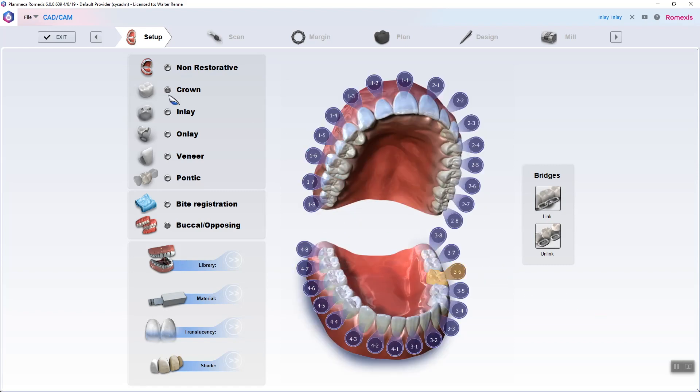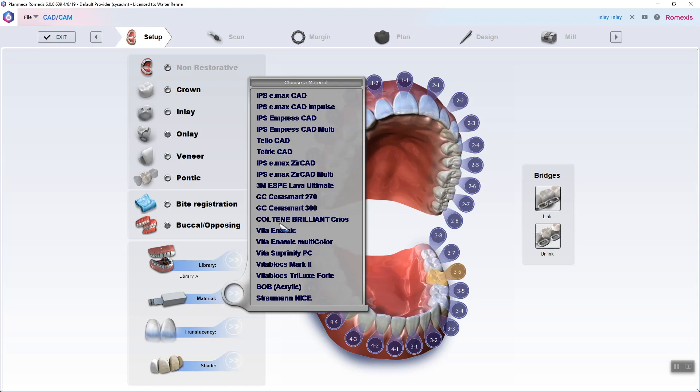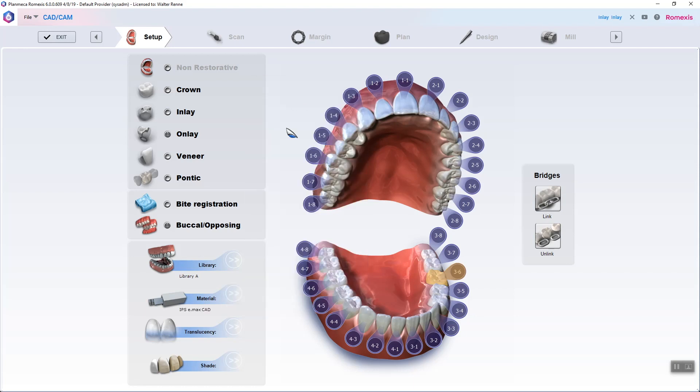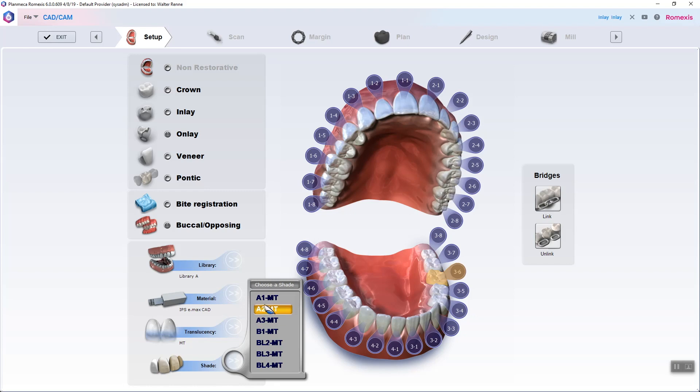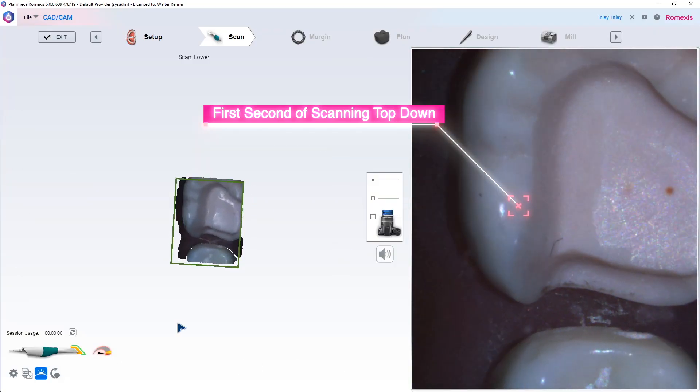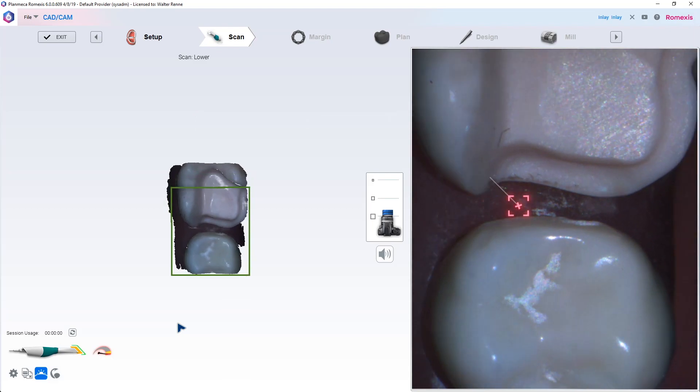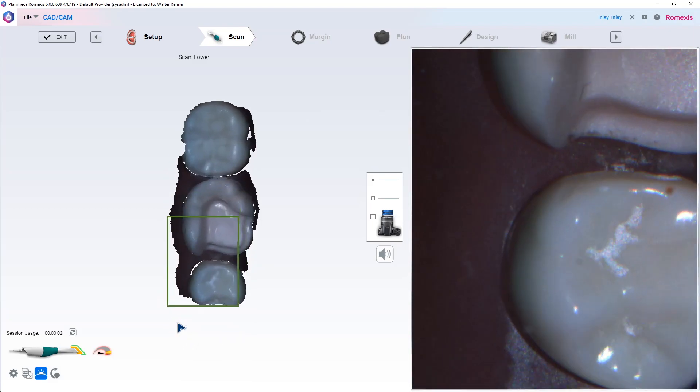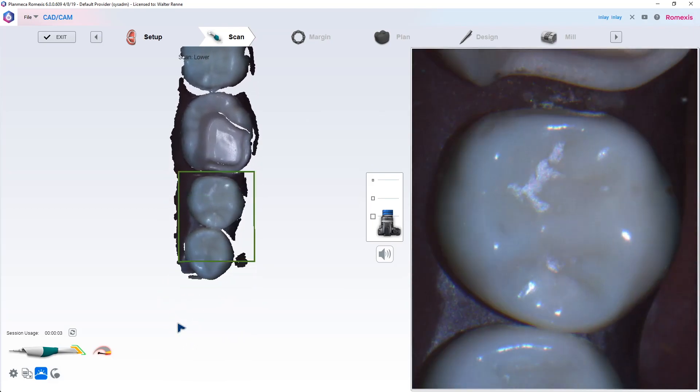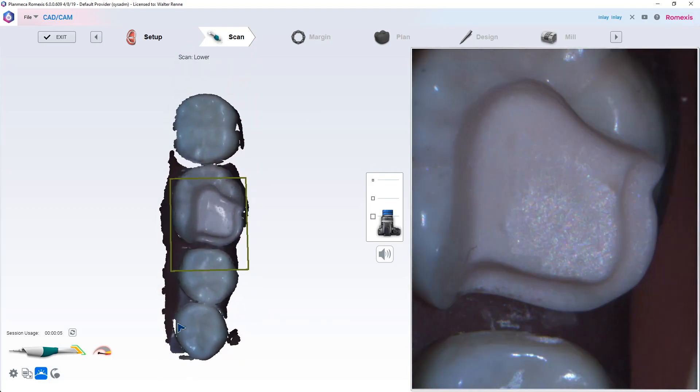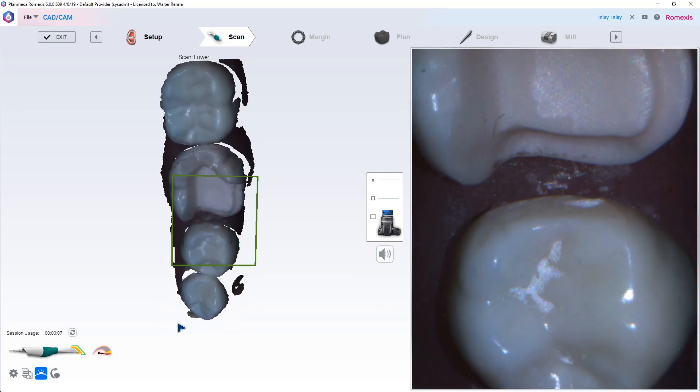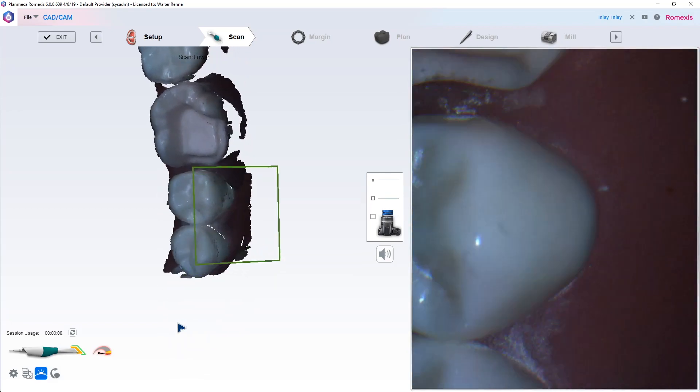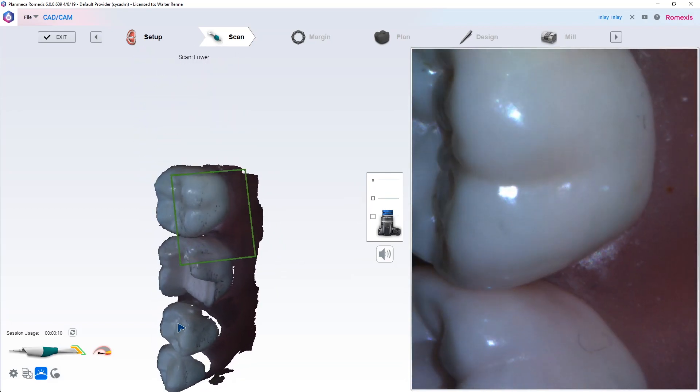Alright, let's move on. Flying here, going through the onlay restoration. Same thing: EMAX medium translucency or high translucency for onlays. First second of scanning, single most important second of your scan, so from the straight down occlusal view. Everything else from there is just rotational based scanning like it is for every other scanner on the market.